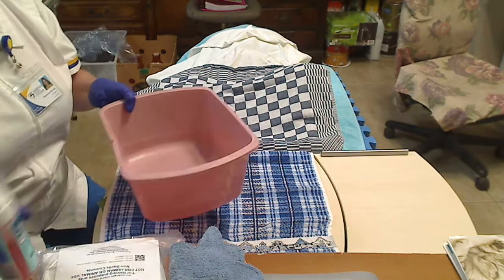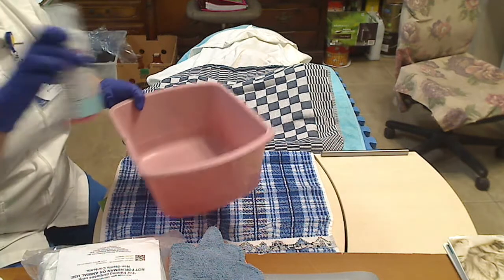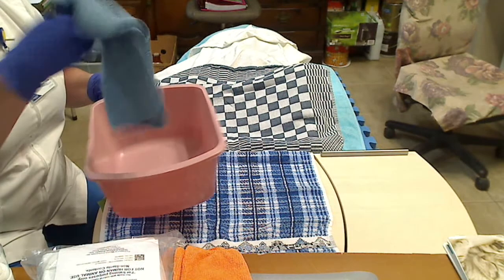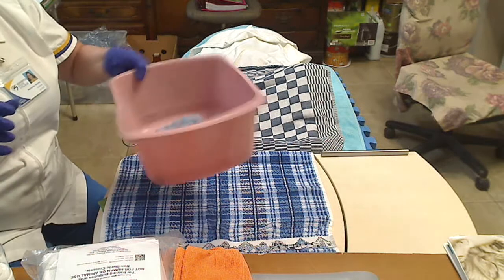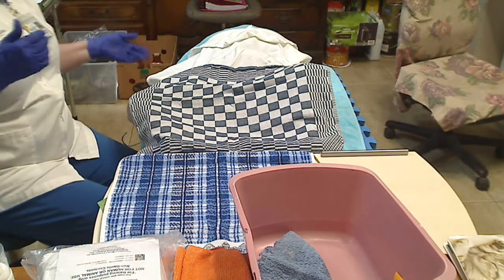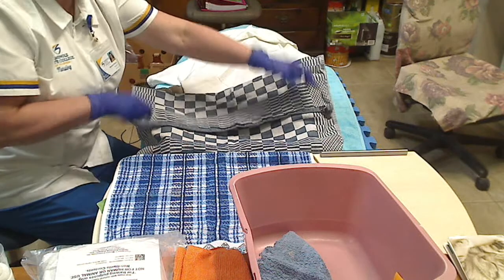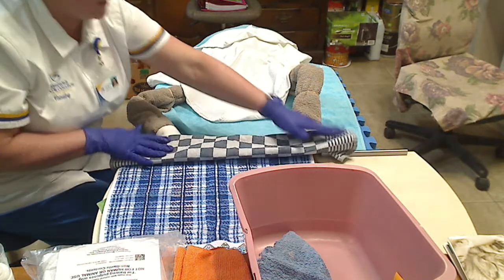I am going to add into the water my Hibiclens so that it's in the water and not concentrated on my rag. And I'm going to go ahead and put my rag into the water so that it's getting all agitated. Okay. Anna, is it okay if I go ahead and uncover you now? Yes. So I'm going to gently uncover her, exposing her lower extremities.